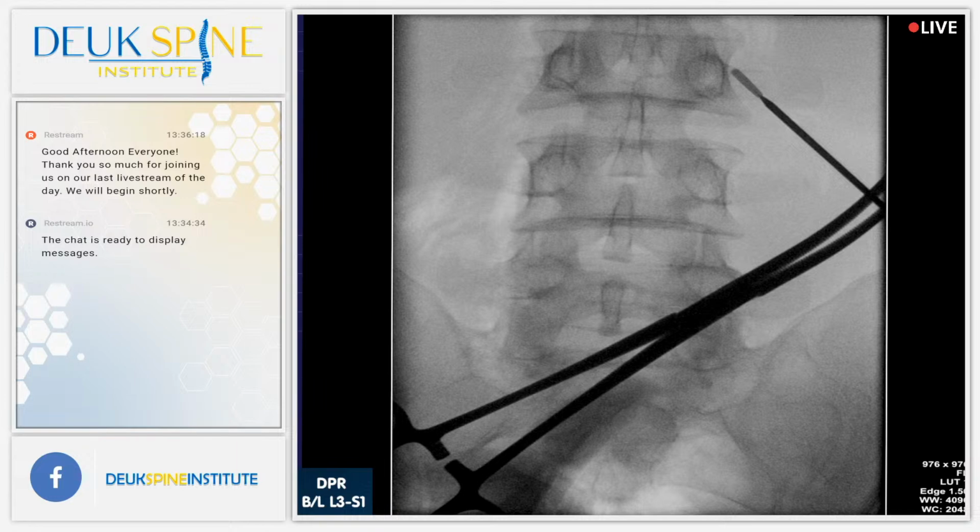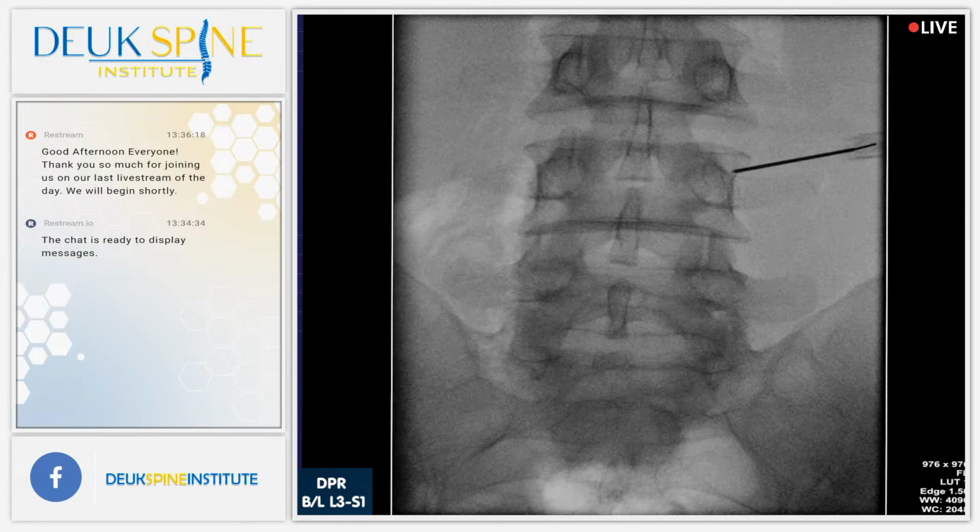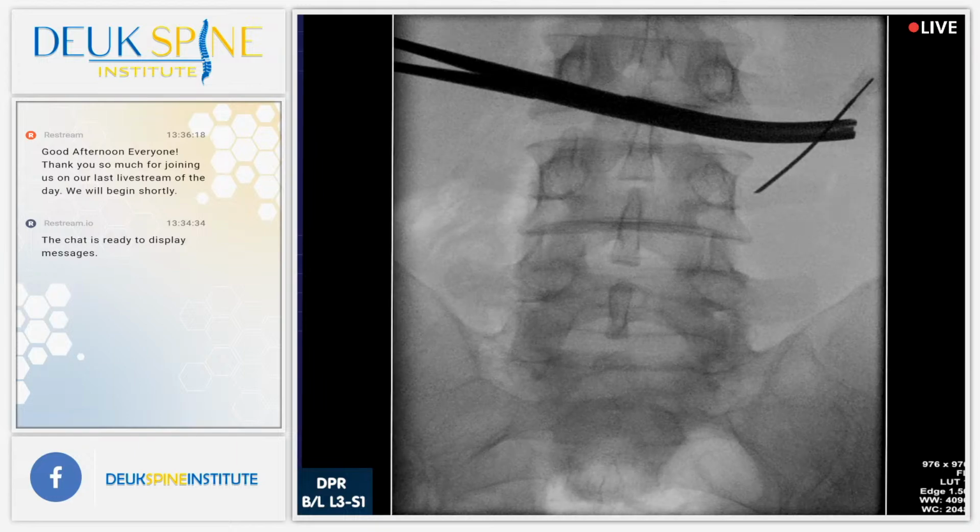Next. Need to be a little lateral. That's not bad. Go ahead.